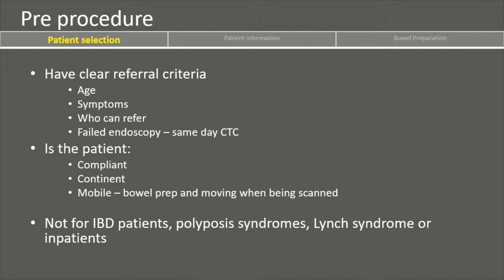If so, again, you need clear documentation of what prep and how you perform these. And in regards to the patient, are they compliant? Are they going to be able to cope with the instructions for bowel preparation and bowel cleansing? Are they continent, not only with regards to bowel prep, but also on the day? Will they be able to keep the gas in?